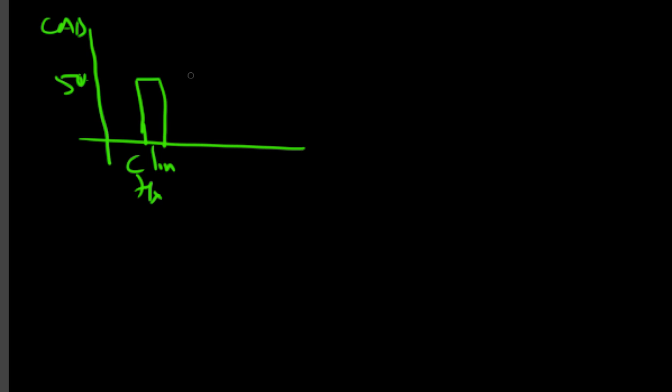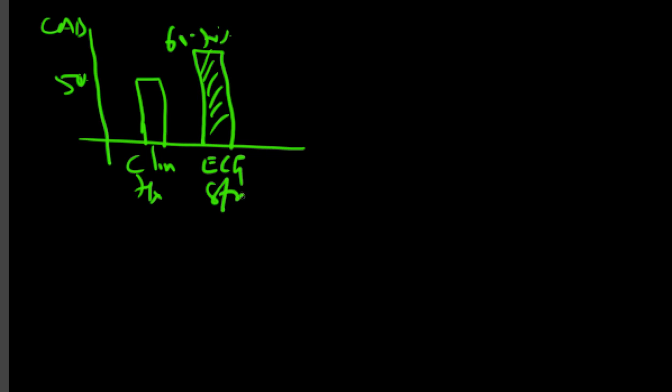So now, let's see if the ECG stress test adds any incremental value to the suspicion of significant coronary artery disease. The data is the following. You improve that by almost 60 to 70%, which we know that ECG stress test will improve your suspicion of significant coronary artery disease by 60 to 70%. One, by functional capacity, and two, by the ECG criteria which we follow.